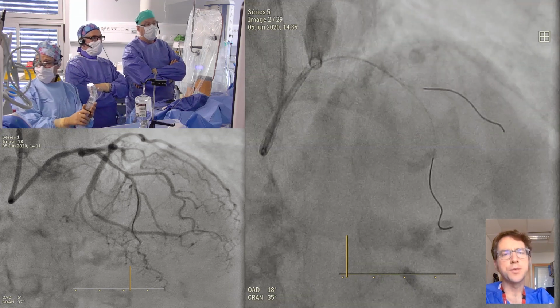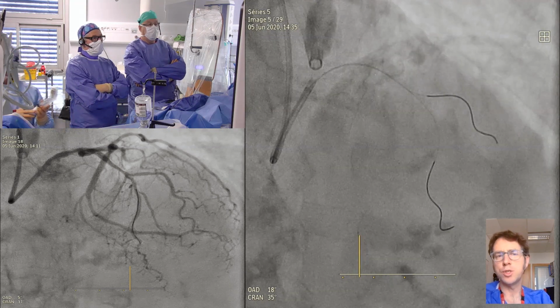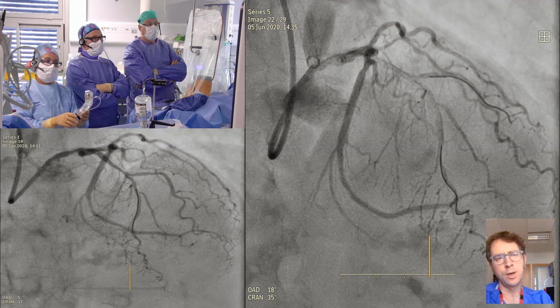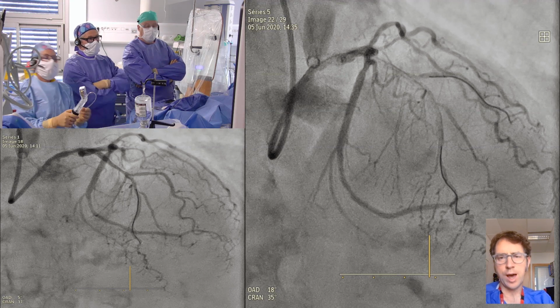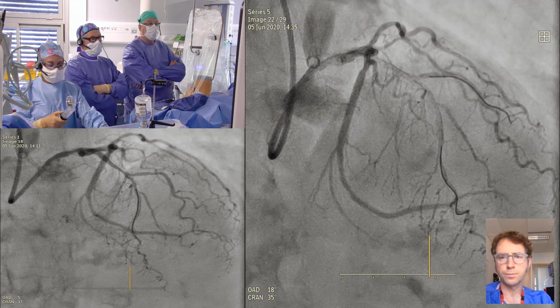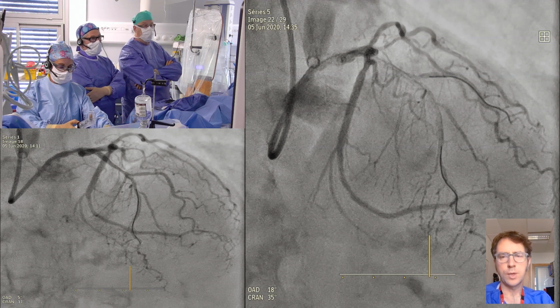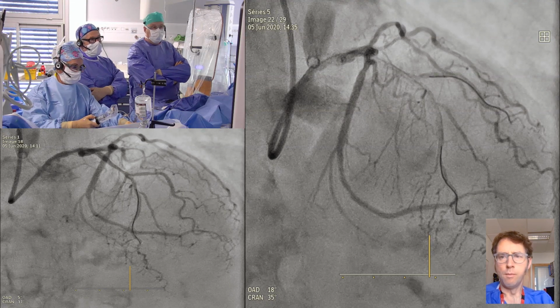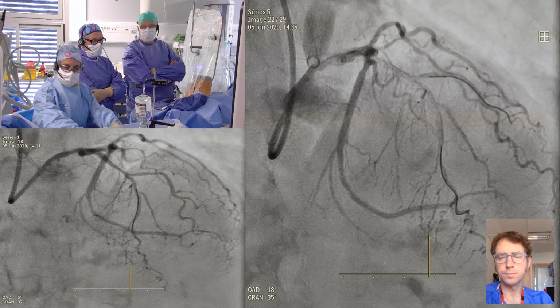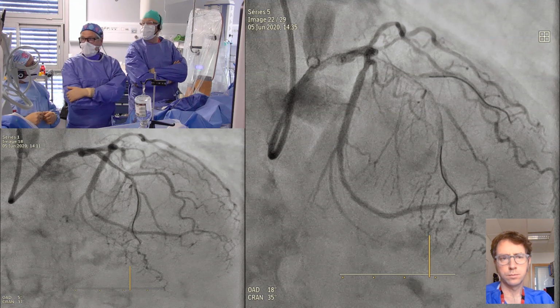With that degree of calcification and having just pre-dilated with a 2 millimeter balloon proximally, would you consider taking a larger balloon just to ensure expansion? Or are you happy? It was a 2.25, so it's not perfect, but we went to 20 atmospheres with very little residual waist. So I think we'll deploy the 2.25 and then do the POT, and we'll select a non-compliant balloon for the POT so we can go to higher pressure.